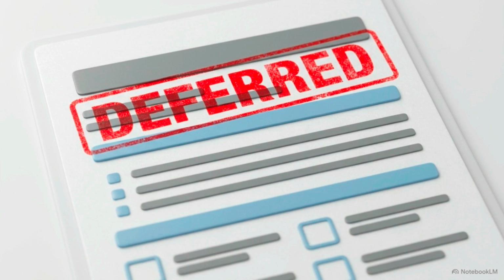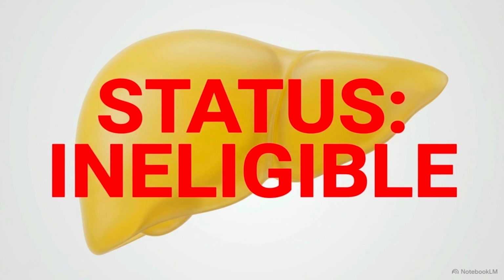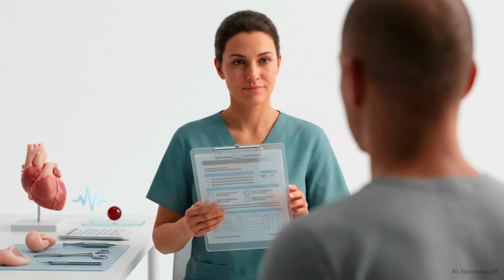Other answers result in an indefinite or permanent deferral. A history of viral hepatitis after the donor's 11th birthday, for instance, immediately and permanently disqualifies them from ever donating blood for someone else. Because certain pathogens cannot be detected by laboratory testing during their incubation periods, this questionnaire acts as an essential epidemiological filter, relying entirely on the privacy and honesty you cultivate with the donor.